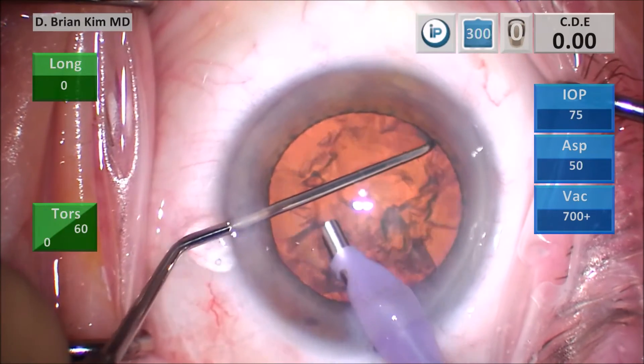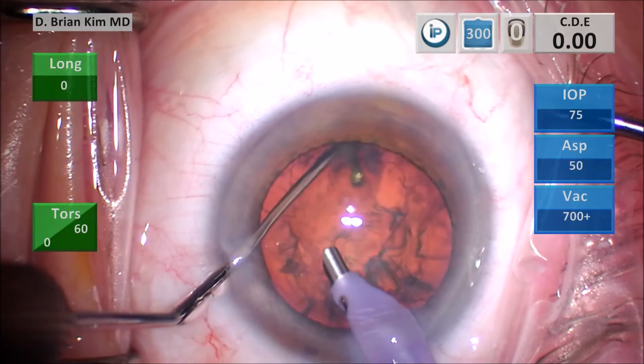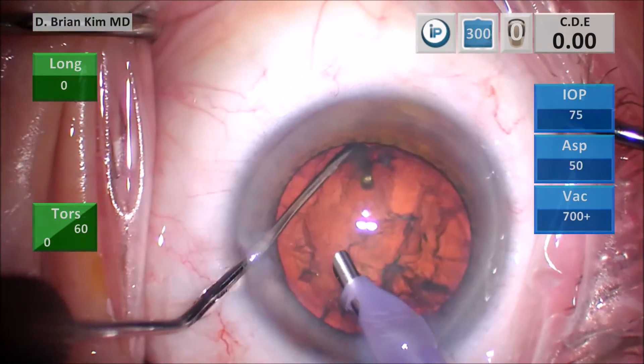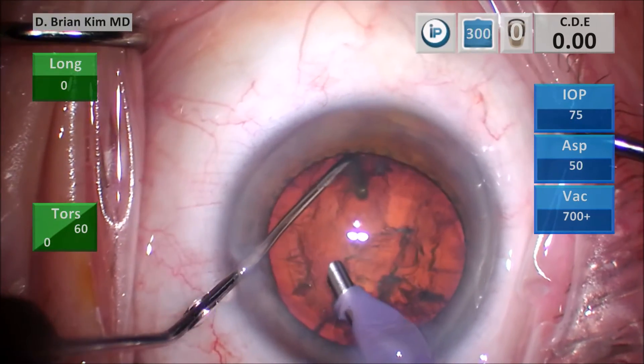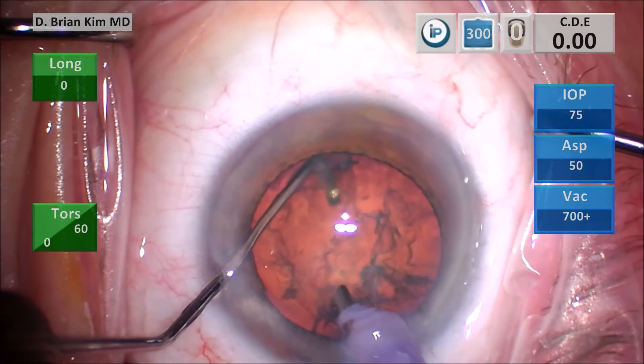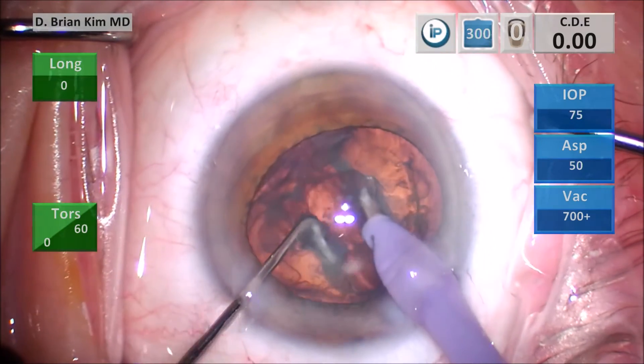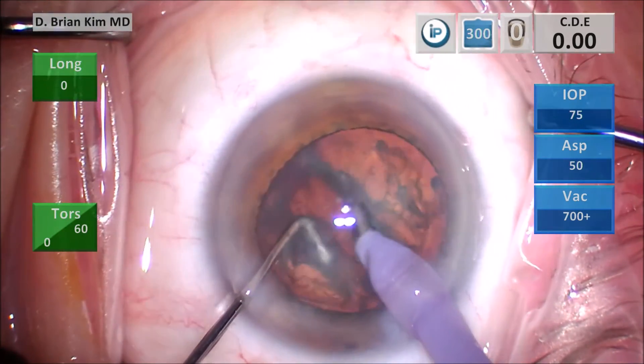Here is this video example again. The chopper is being placed out, rotated, supinating my hand — the chopper is in place in a vertical position. You can see I'm lifting that lens for illustrative purposes. Now I'm going to rotate and tilt the facotip more vertically, and then both instruments meet in the middle and the lens is chopped.